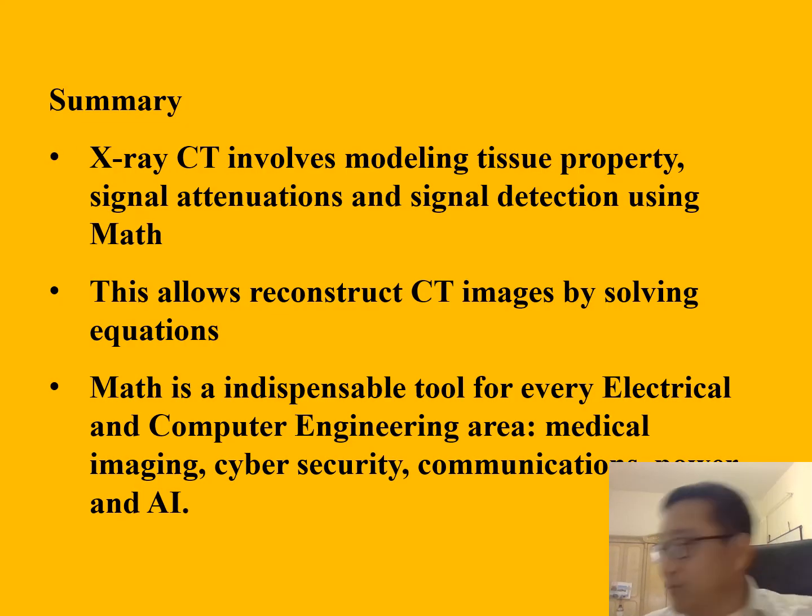Okay, I guess I have to conclude. So we talked about X-ray CT and the mathematics and physics behind it. You already see that we basically do reconstruction by either solving equations or using other mathematical operations such as filtered back projection.